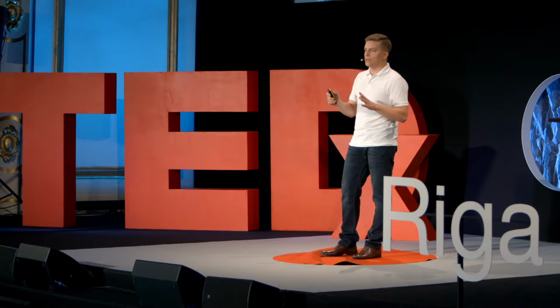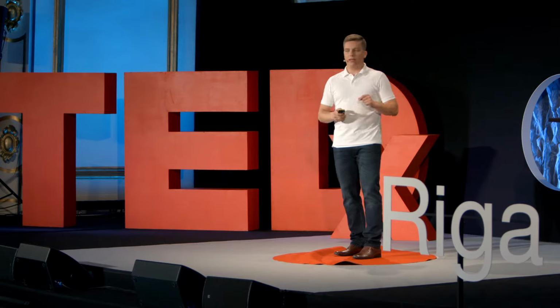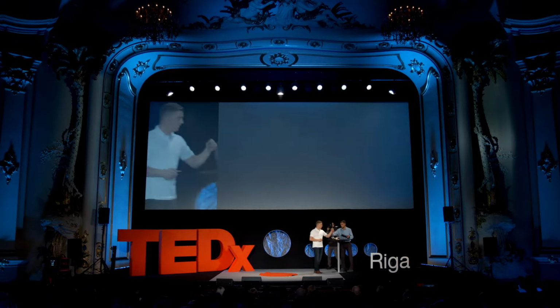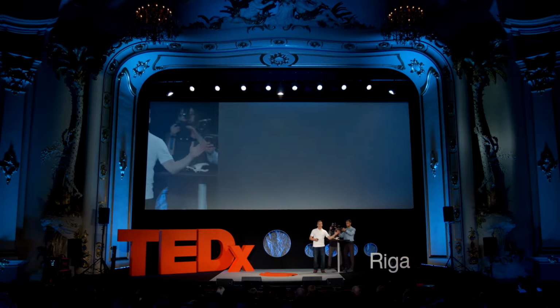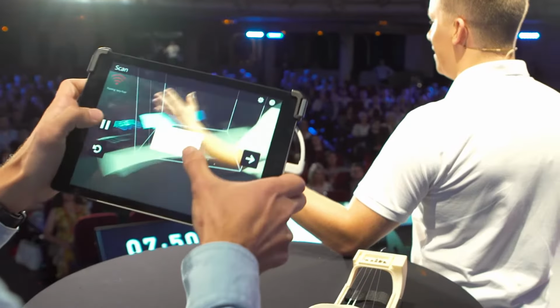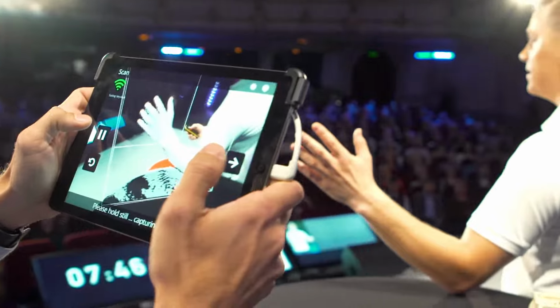So why smartphones? Because smartphones are capable of processing 3D data. And what's more important, they can also make 3D scans. To illustrate how easy it is to make a 3D scan, I have asked my colleague Fritzi to join me on stage. In about 60 seconds, Fritzi will make a 3D scan of my hand. And this scan will have sufficient detail to actually create me a prosthesis.